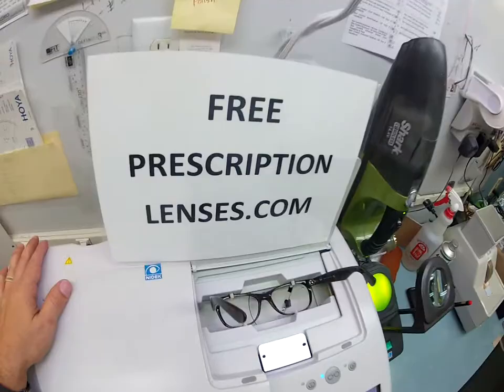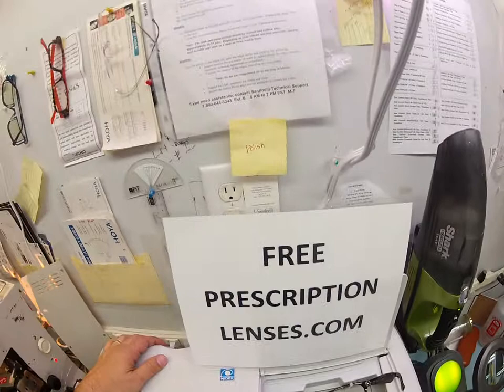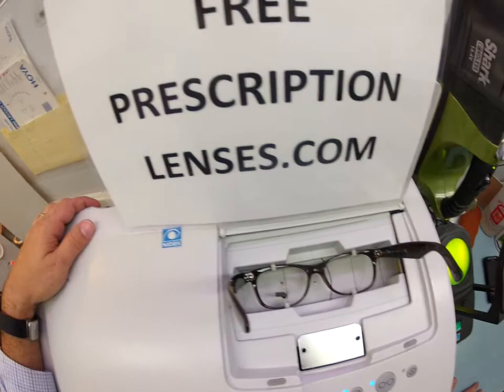I'm going to put your Italian frame into my Santanelli LE1000 patternless edger. It is now tracing the shape of your right lens and then it's going to scoot over and trace the shape of your left.